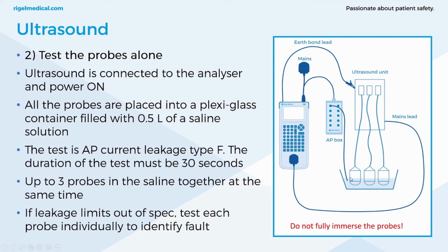Obviously, these gels are water-based, they're conductive. Not only that, they're designed to remove air, which is an insulator, to allow ultrasound waves to move into the body from the probe. And that's what the gel is doing. So not only is it making it conductive to the sound waves, it's also making it conductive to electricity, or potentially conductive.